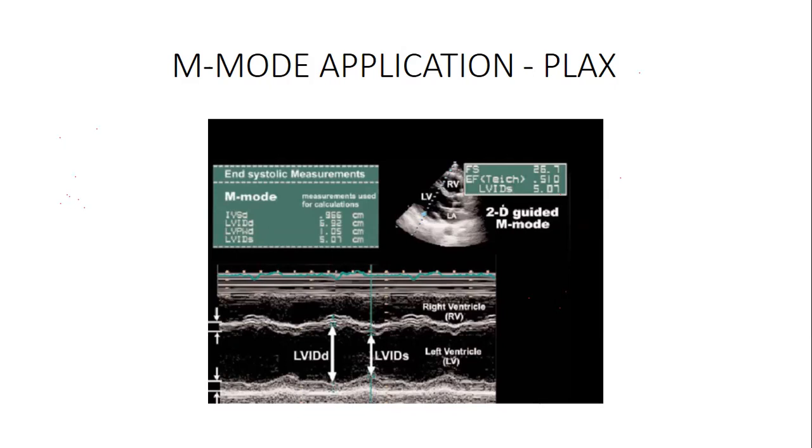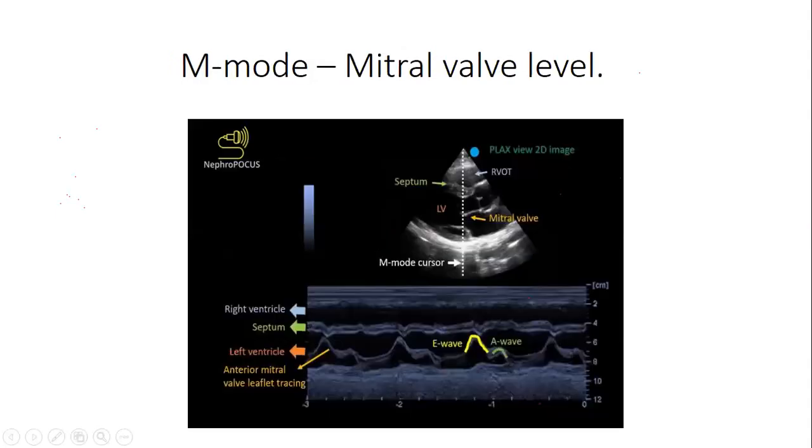That difference calculates automatically the ejection fraction. That's why if you see here, there is a septum, there is an internal diameter, there are all those things, and here it's giving the ejection fraction. I will show you even how to do it manually so that you understand, and also how to do it with the machine, because the machine does all these calculations. The secret is do the correct technique. Don't worry. I'll explain all those details. For now, orient yourself to what is going on.